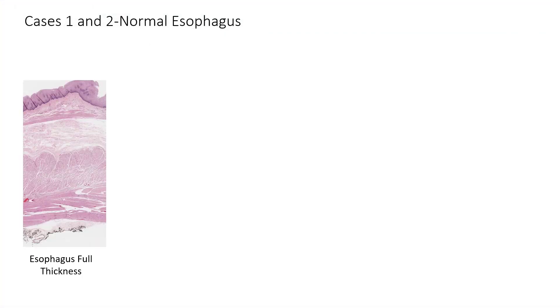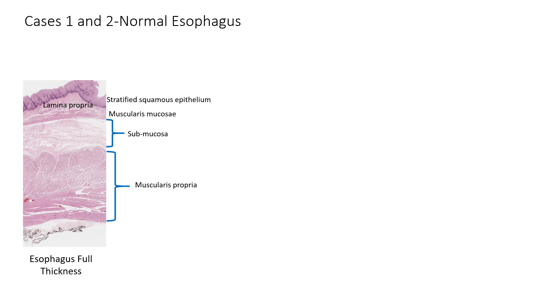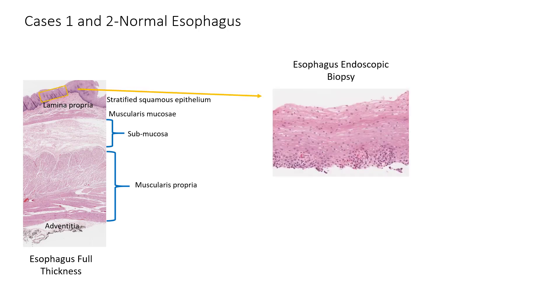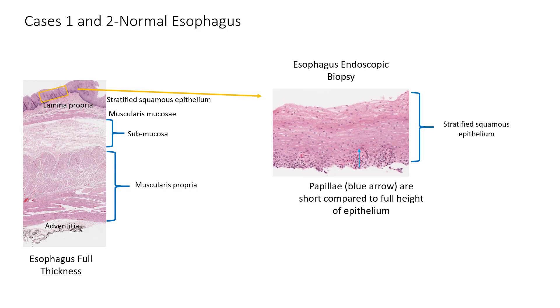Cases 1 and 2 are normal esophagus. Here is our full thickness section with the stratified squamous epithelium, lamina propria, muscularis mucosa, submucosa, muscularis propria, and adventitia. Here is our endoscopic biopsy, which consists only of the squamous epithelium. The blue arrow points out the length of a papilla — these are quite short compared to the full thickness of the epithelium, which is normal. Remember, endoscopic biopsies only sample superficial tissues and do not sample full thickness, because that would produce a hole in the gastrointestinal tract.